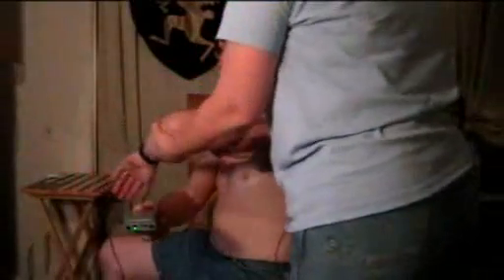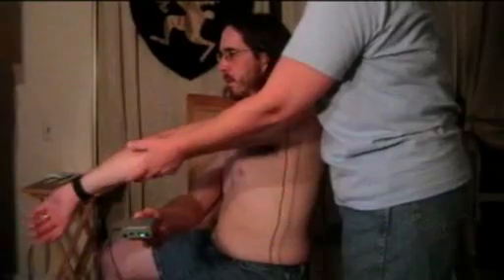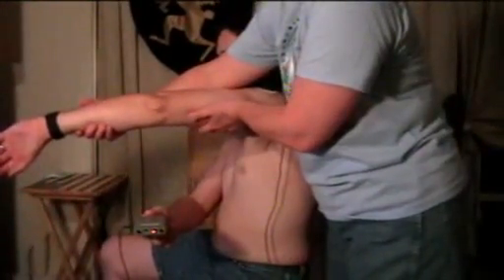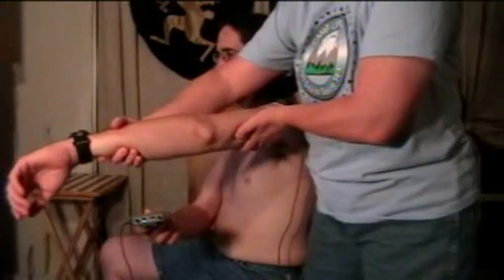Put the arm back across the front and tense up your deltoid across the front — right there. Have them cross it to a point where it activates, and then have them turn it off, relax the arm, drop it into my hand. Then move it out a little bit and have them think about crossing the arm in front and maybe even try to do it, which will activate that muscle.